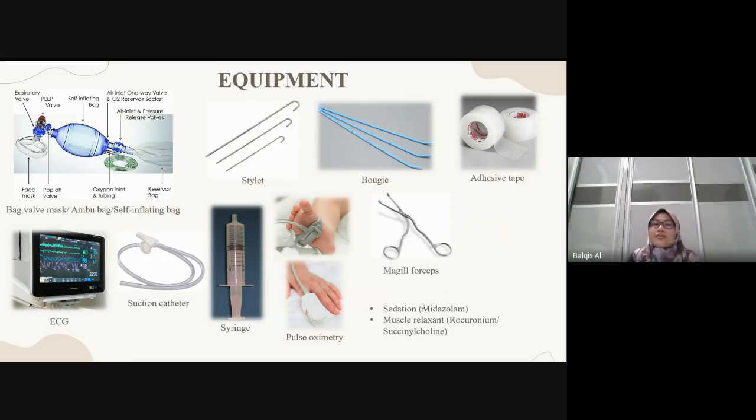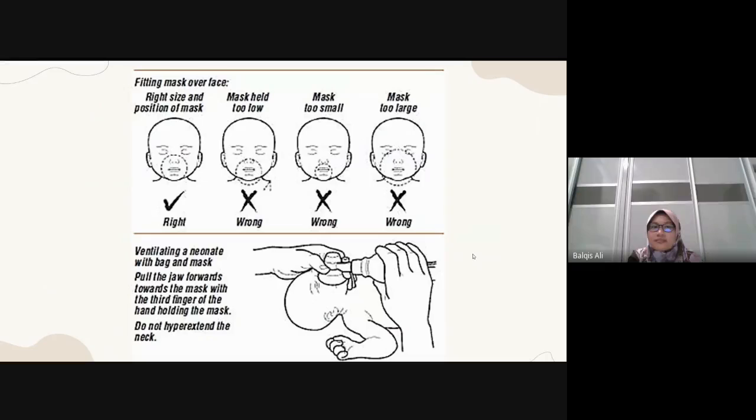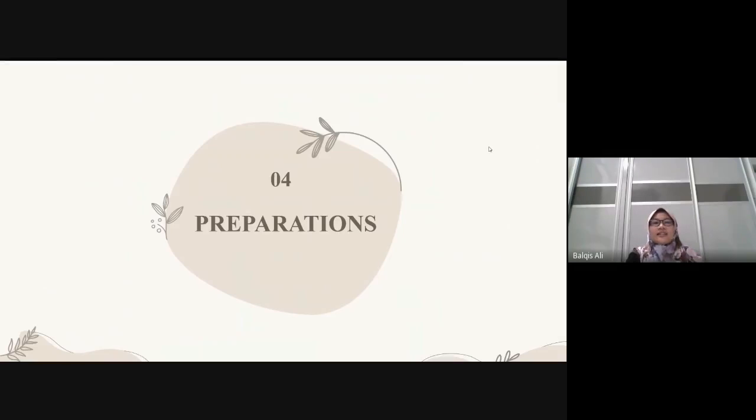So we can also inject the sedation and also muscle relaxation to the patient before we do the intubation. This is the right size and position of the bag mask ventilation. Okay, then proceed to the preparation.